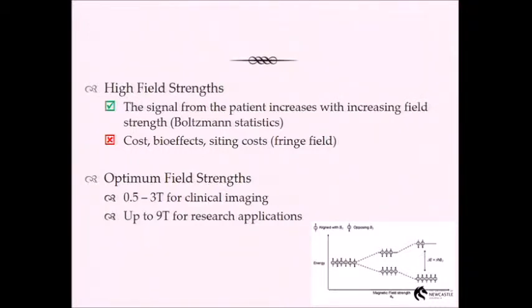And if you think about one of the measures that we talk about, you may not have seen it, but I can go back and show you at the end. Down the bottom of that blue interface, in the very right-hand corner, there's a measurement called SAR, the specific absorption rate. Next time you look at your mobile phone manual, go to the last page and you'll see there's a SAR reading. So anything that's dealing with radio frequencies has a SAR, a specific absorption rate, associated with it. But we generally consider MR to be safe.